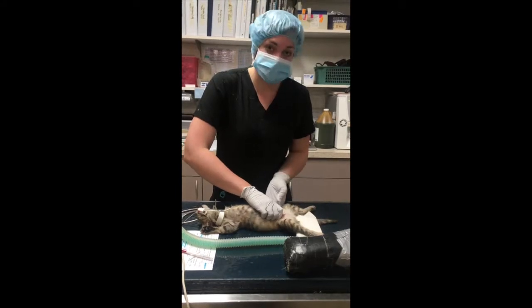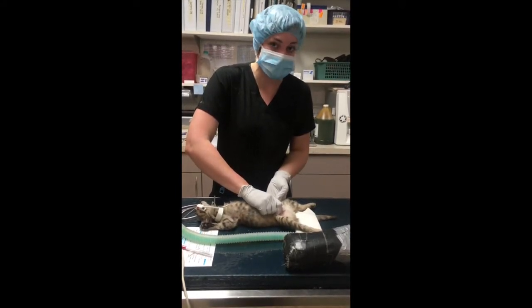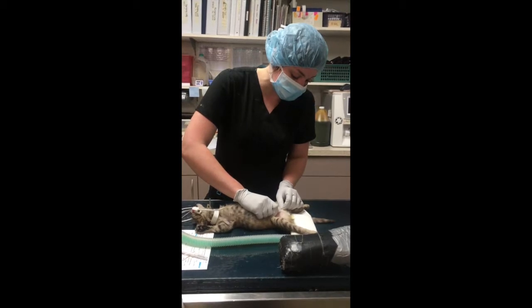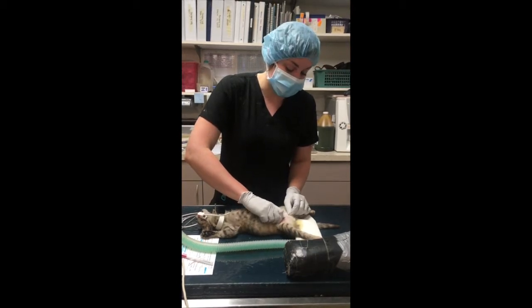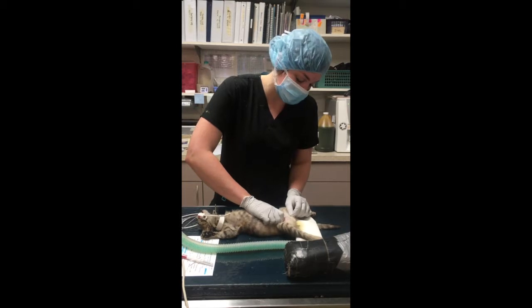And if there is one, and she does have one, you can go ahead and squeeze it very, very gently. You don't want to squeeze very hard because you can risk rupturing the bladder. You can see that she is urinating, so I'm just going to gently squeeze. This helps the doctor visualize and have better access to the uterus for a spay procedure.